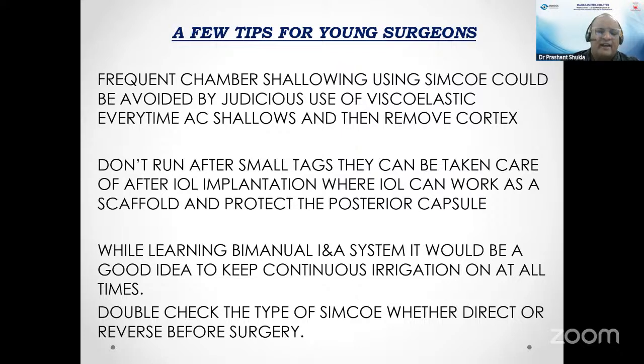Reverse Simcoe we hardly use in our surgeries, but once I had this instance of a reverse Simcoe being delivered to me, and in the surgery the fluid was coming out from the aspiration port, and every time I went near the cortex, it was just moving here and there. So it's always better to check the Simcoe which we use before surgery.